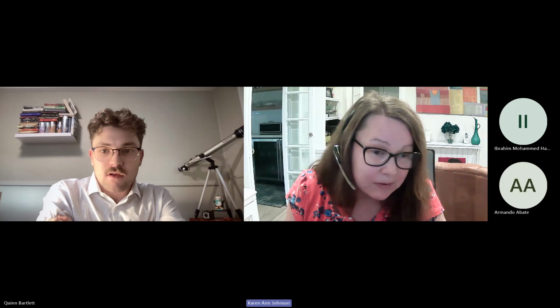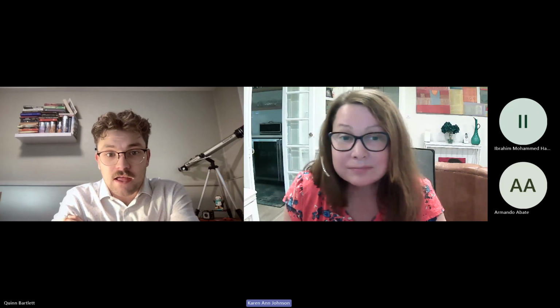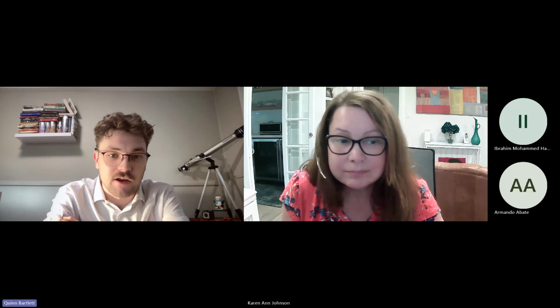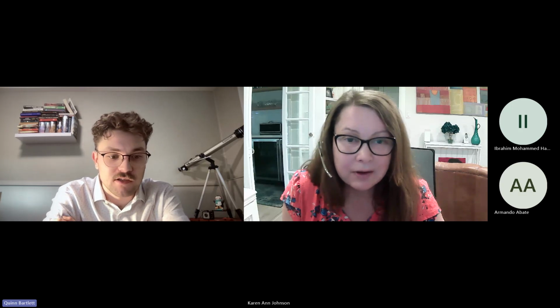You can tell me though what TRS 398 is. That's just a new one. It's the same quality assurance testing, it's just in other parts of the world. Oh, I see. In North America, we call it TG51. They call it TRS 398. Okay.